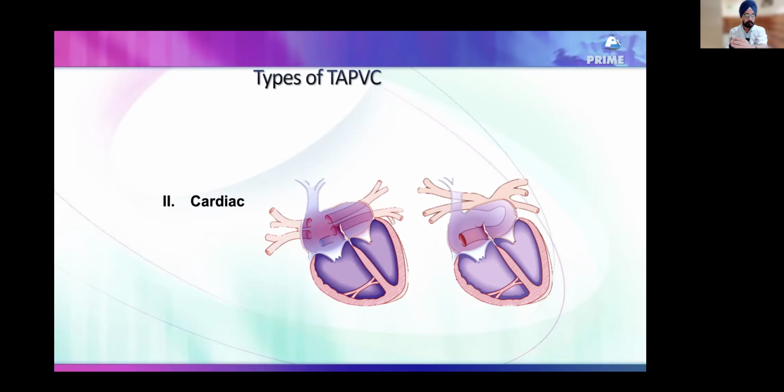Done. Then the next is the common chamber through a vein, not vertical here, which opens into one end of the coronary sinus. And the coronary sinus, which is sealed from the left atrium, goes and drains into the right atrium.